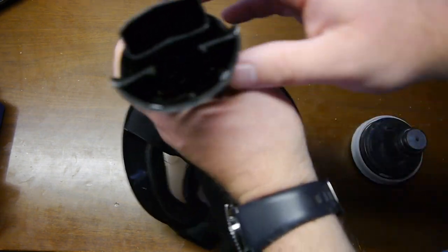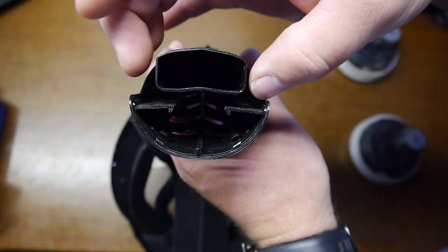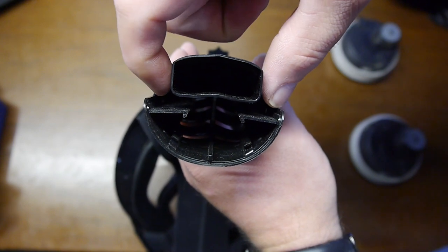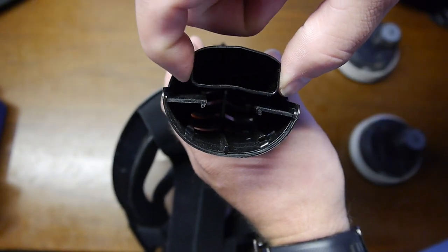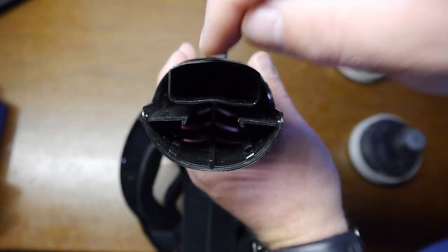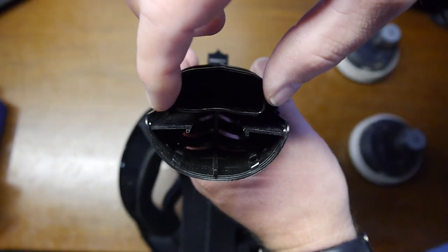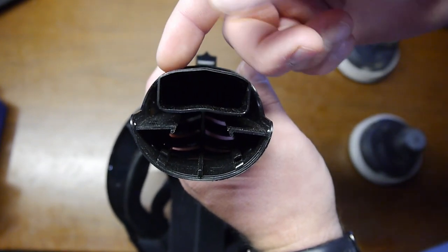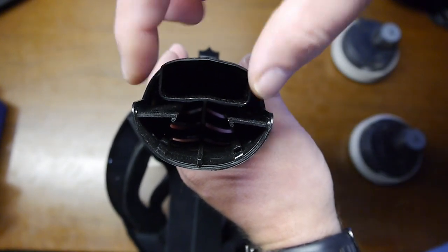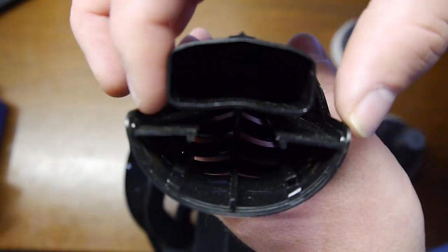So essentially what I did was I took a picture of this just like this, as direct, as centered as I could be with the camera picture. Then I took a pair of calipers and measured from here to here with them. Got that measurement, and then I imported this into my CAD program, into the 2D sketch area. Drew a line from here to here, got the distance that it imported as, and then just did math, right? So if this needed to be 1.5 inches, and it was 1 inch, you would do the 1.5 divided by 1 inch, and that's your scale factor. And then you would scale up your picture to be that scale, double check it's correct.